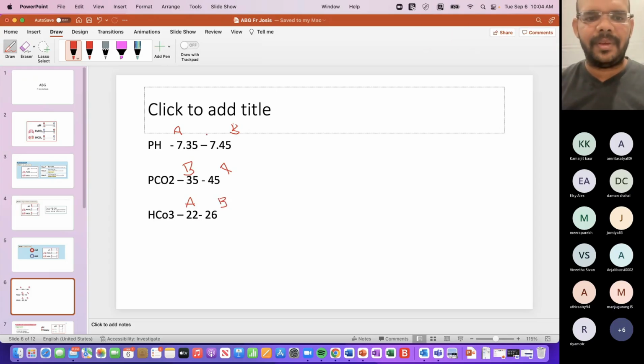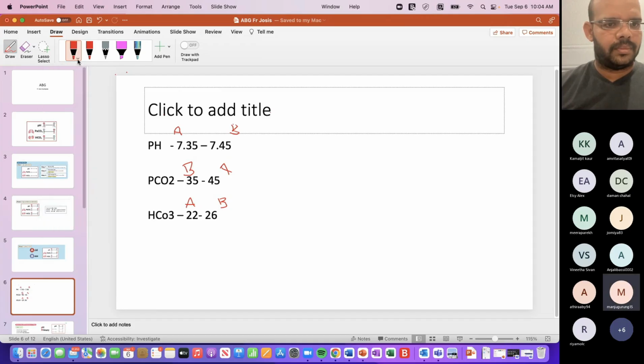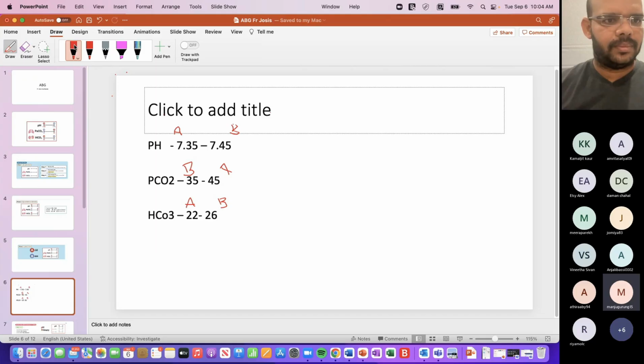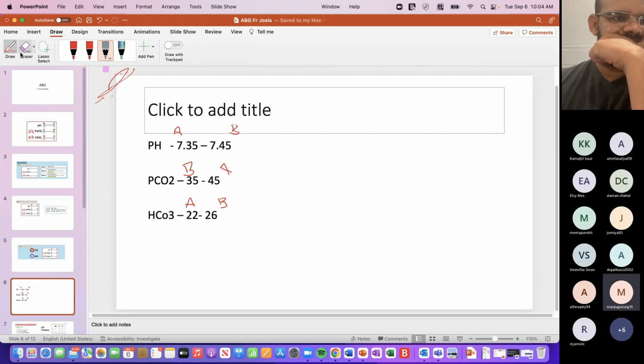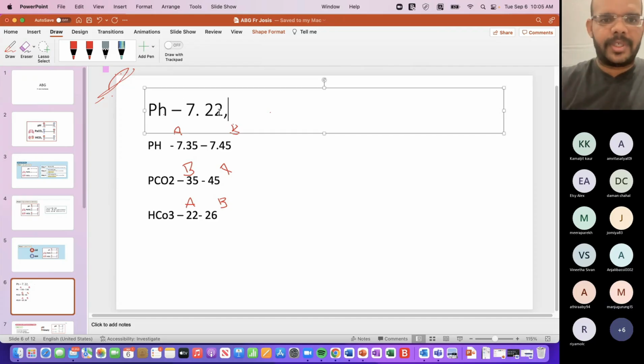If your value is given, for example, let's do a question. pH is 7.22.